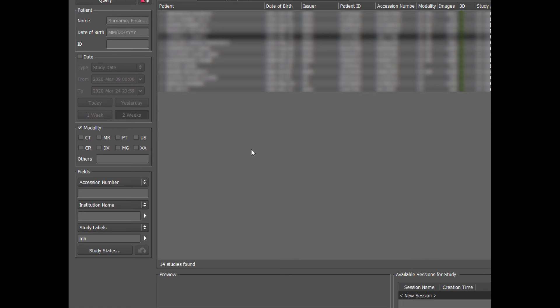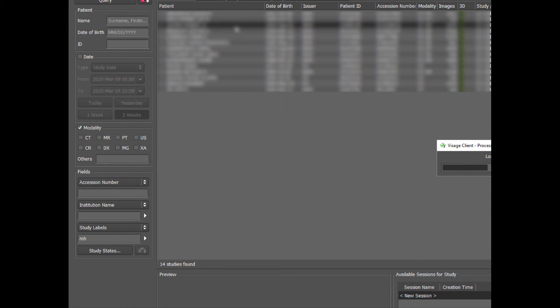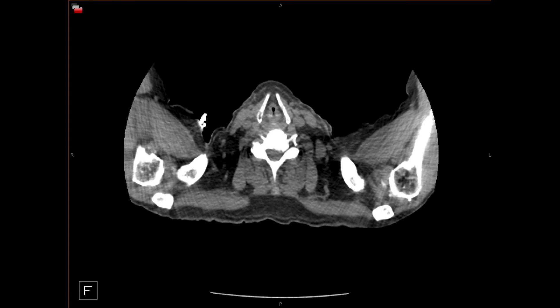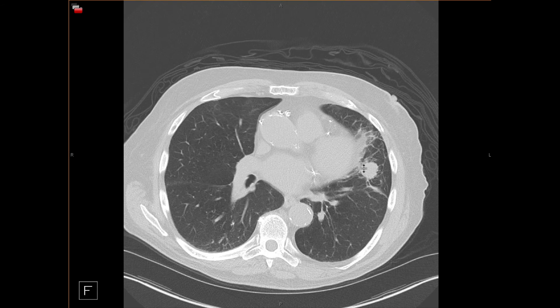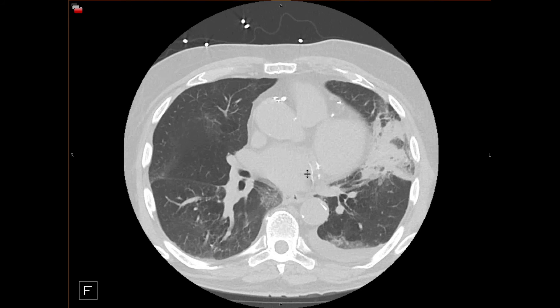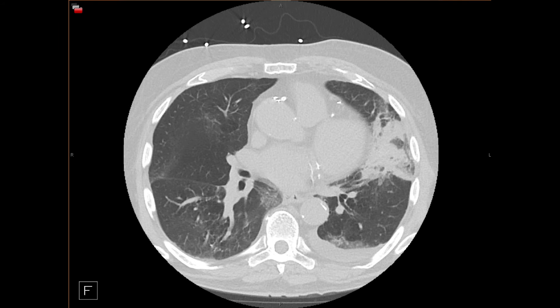Finally, post-treatment changes can produce the reverse halo sign. This patient had a nodule in the lingula treated with microwave ablation. On post-ablation CT, you can see peripheral consolidation and central clearing — the treated nodule is buried within it. Both radiofrequency and microwave ablation give a reverse halo appearance that indicates the treated zone in the lung, and this will eventually contract over time.